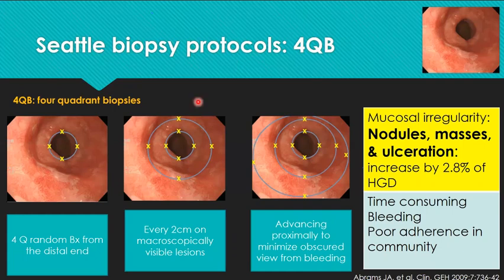It's quite a huge protocol. But biopsy on the distal esophagus is not easy because of the tangential direction. Tangential direction means whenever we push out the biopsy tips, there's always slipping.